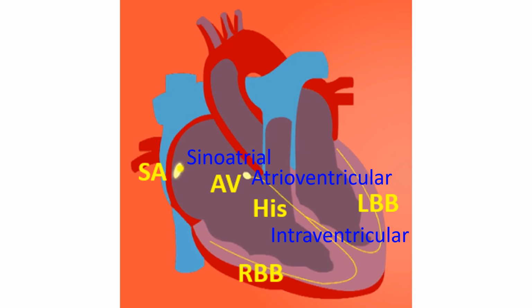Similarly, there could be interatrial and intra-atrial conduction abnormalities as well. The former is between the two upper chambers, while the latter is within the upper chamber.